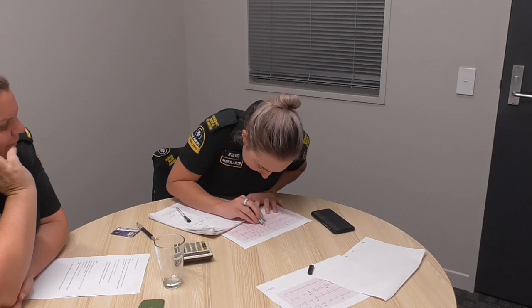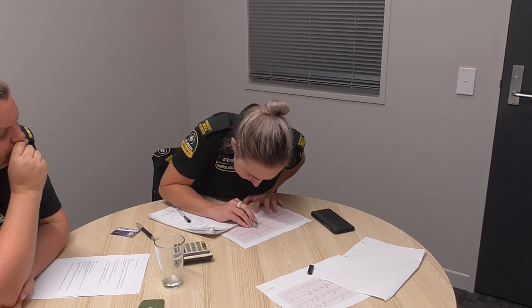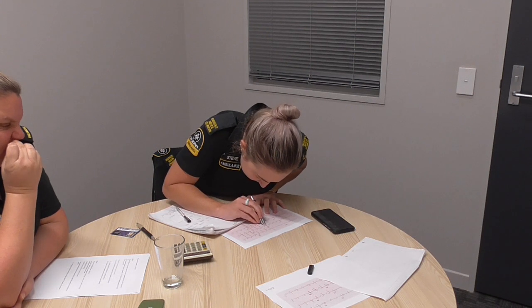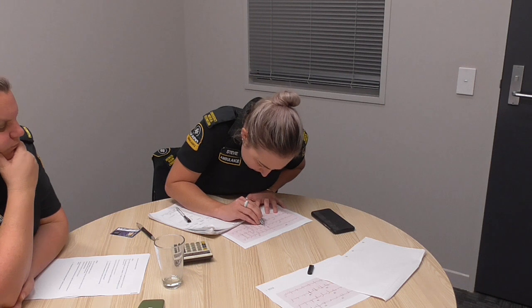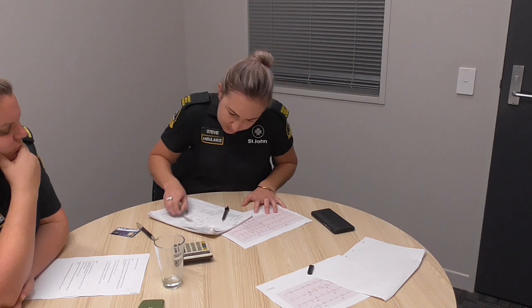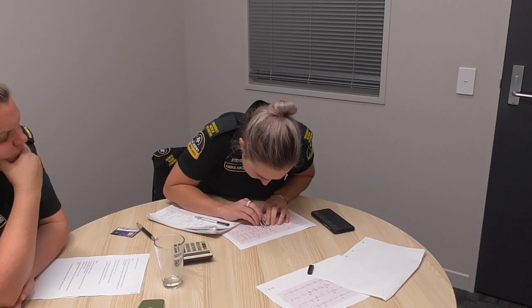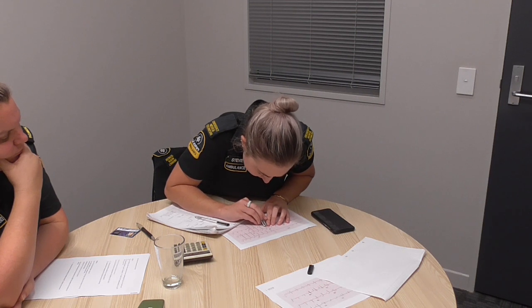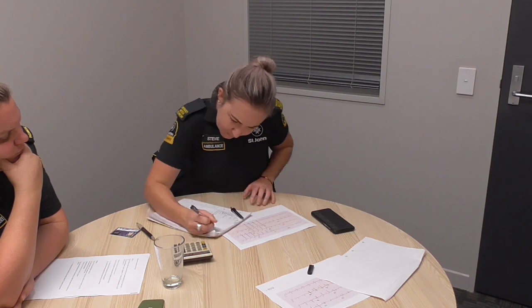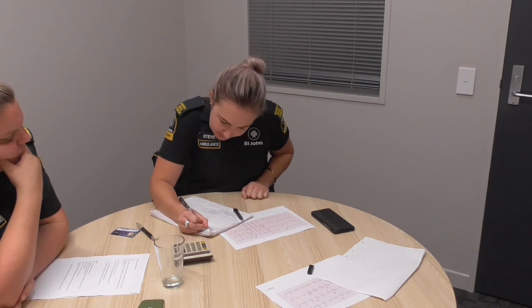QRS is wide, approximately 0.16, because it's more than 0.12, then it's considered wide.